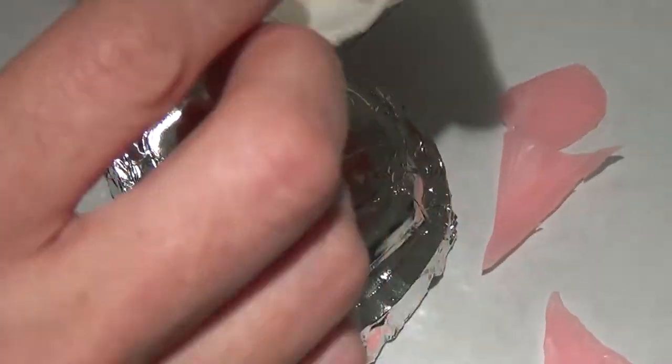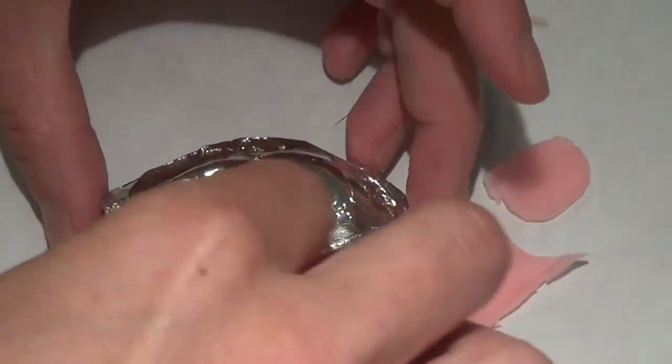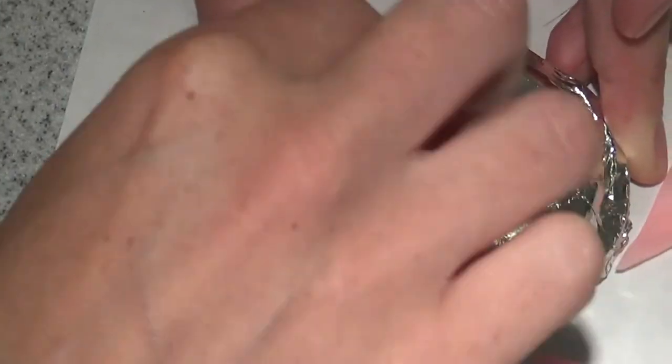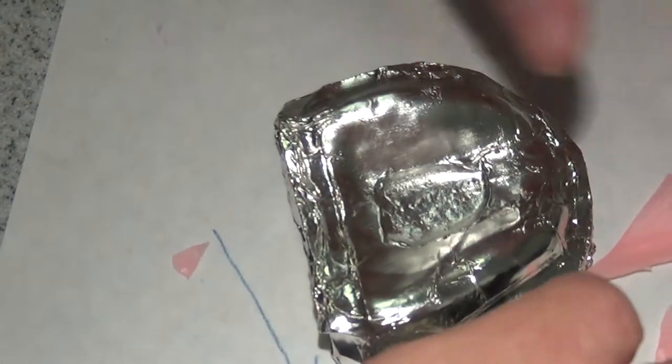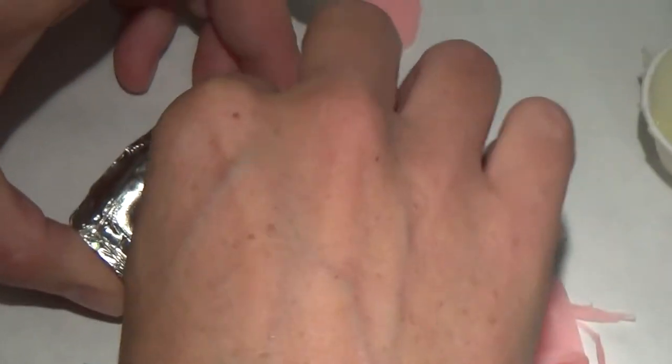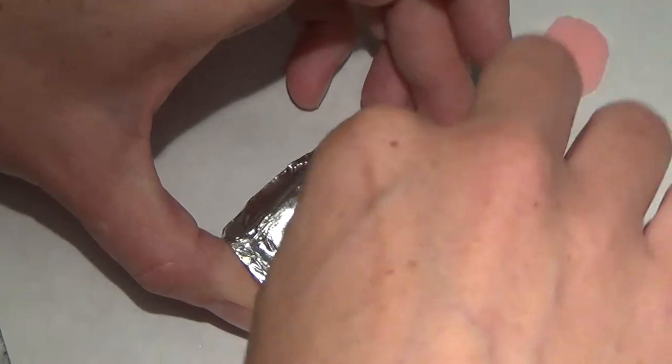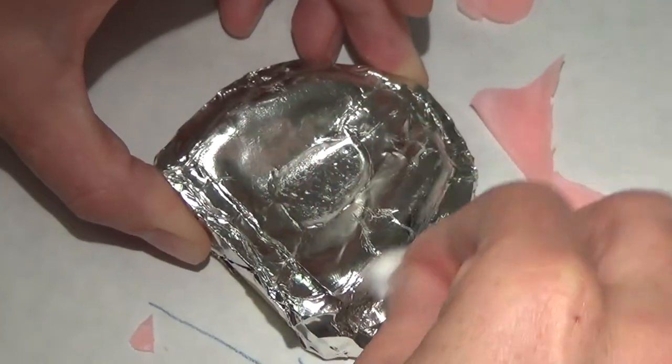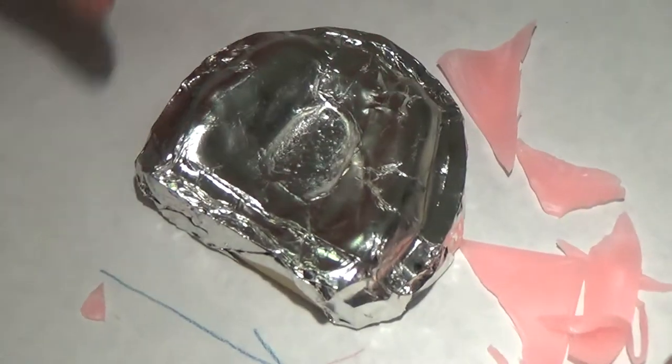I'm going to do some Vaseline. Just a thin layer. You don't need a lot. You want to be a little bit generous because if you do this step, you don't have to add Vaseline to the intaglio of it before you cure the inside. If you've got good Vaseline here.